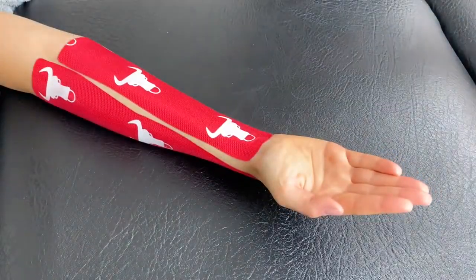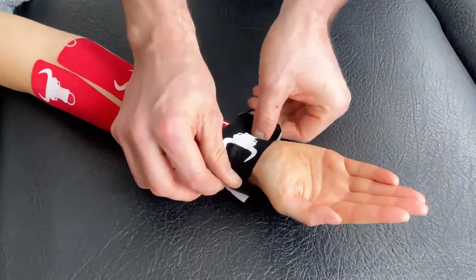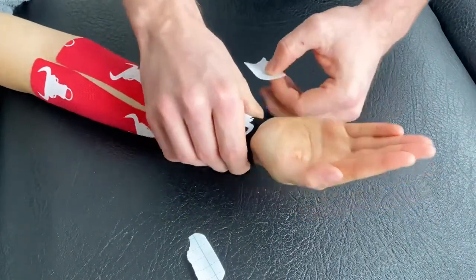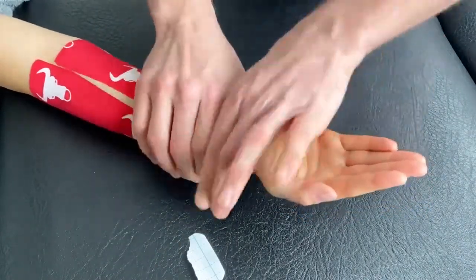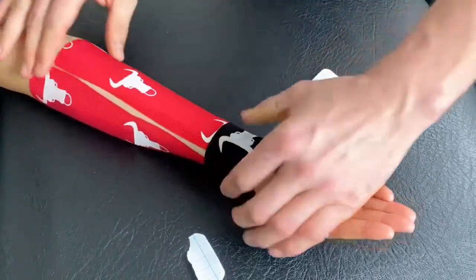A decompression patch can be placed over the wrist with moderate stretch like so. Once done, apply some heat to the tape for some pressure.